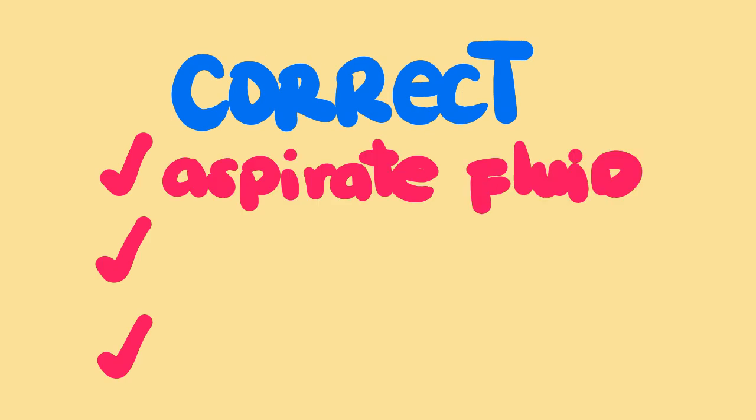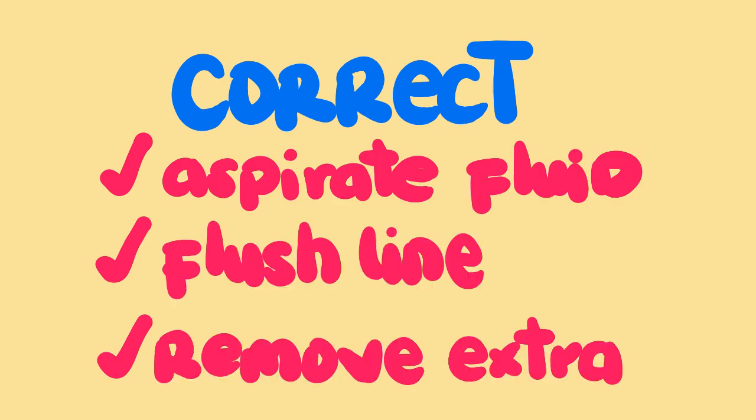To correct an under or over damped waveform, aspirate the fluid, flush the line, and remove the extra tubings attached.